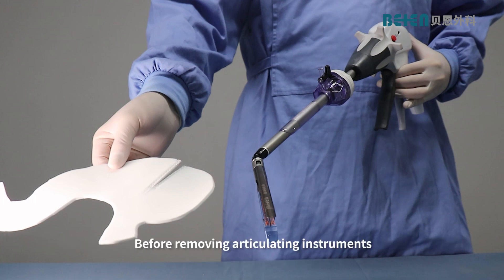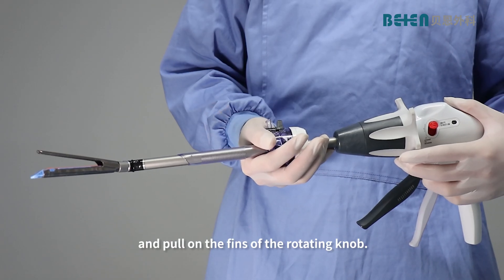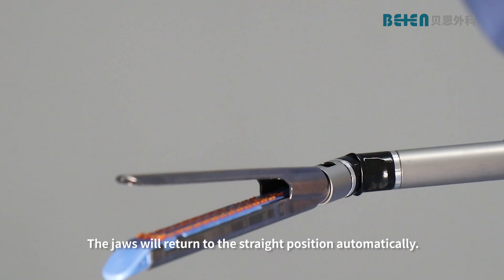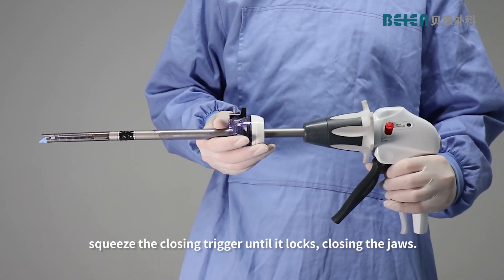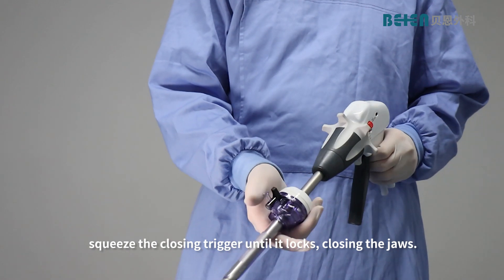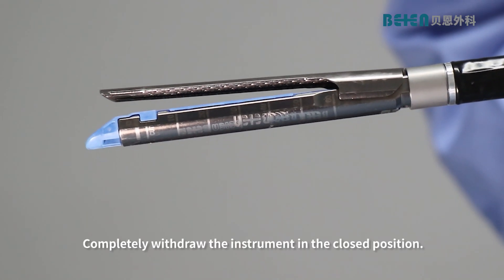Before removing articulating instruments, move the jaws away from any obstruction inside the body cavity while keeping the jaws open and within the field of view. Pull on the fins of the rotating knob — the jaws will return to the straight position automatically. Squeeze the closing trigger until it locks, closing the jaws. Completely withdraw the instrument in the closed position.